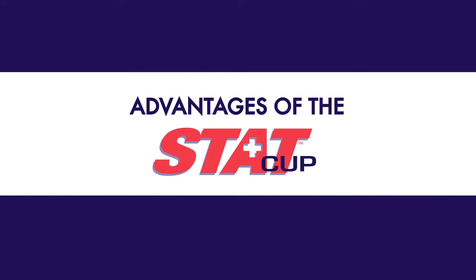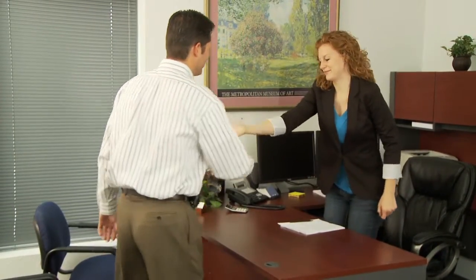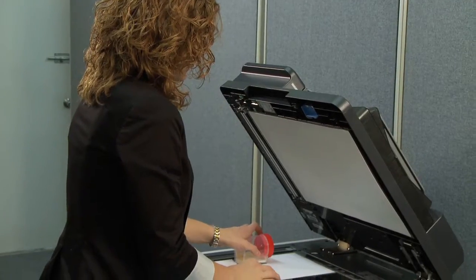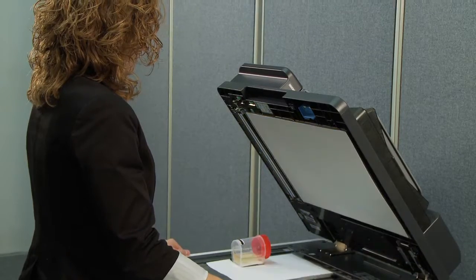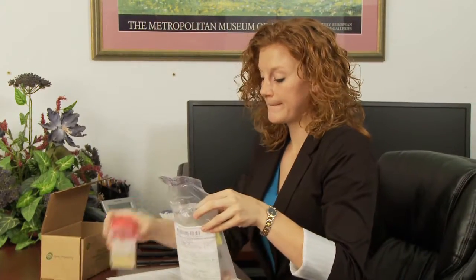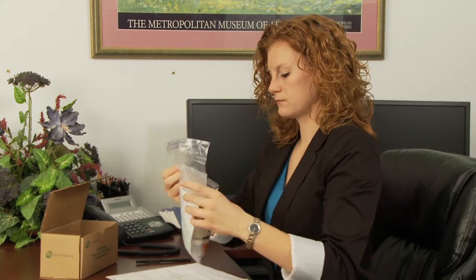Advantages of the StatCup. StatCup's integrated design means there is no risk of urine exposure to the test administrator. The test requires no activation, only a collection and interpretation of results. StatCup's flat face allows the administrator to photocopy test results for record keeping. Transportation is also simplified for those tests that need confirmation for preliminary positive results.